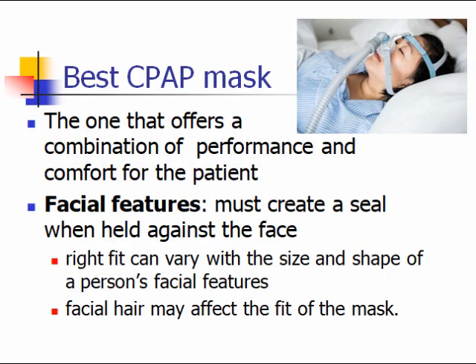The best CPAP is the one that creates a seal when held against the face. The right fit can vary with size and shape of the person's face and features. So there is no one CPAP mask that you can say, this is the best. It is only the best when it fits the best on the patient. What works for one patient may not work for the next patient.